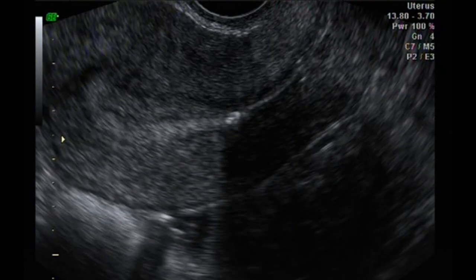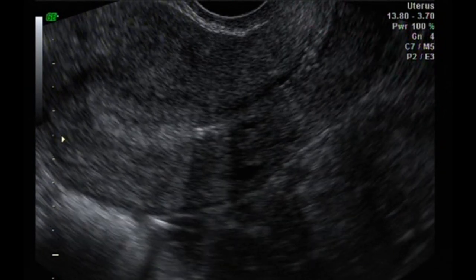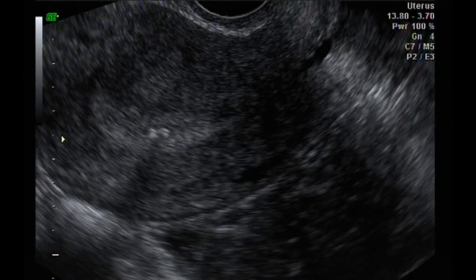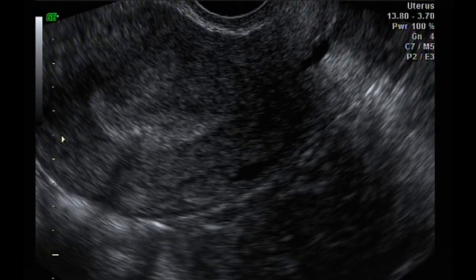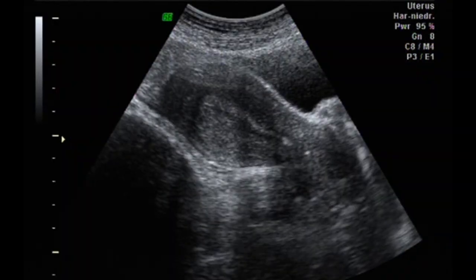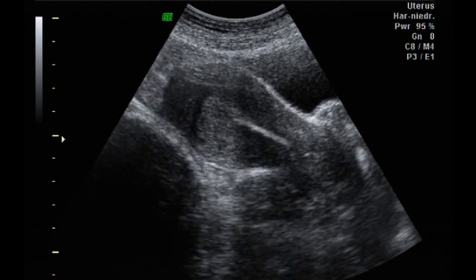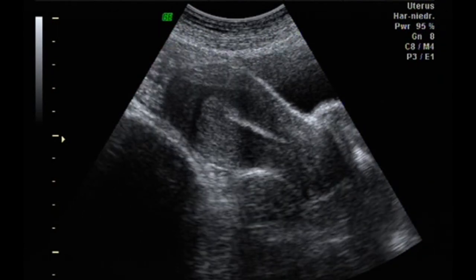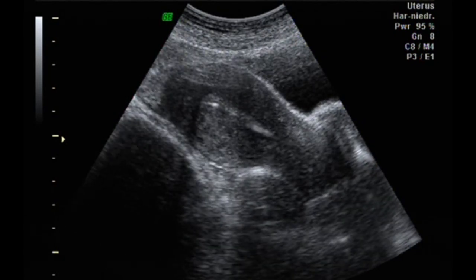Let me show you an actual video of a transvaginal guided embryo transfer. You could appreciate the echogenic tip of the inserted outer guide and the inner catheter moving out slowly and advancing towards the fundus. After injection, the marker air bubbles could be readily appreciated. In comparison, this video shows a classical transabdominal ultrasound guided approach with an echogenic catheter from a different manufacturer. Although this is a very nicely documented video, its resolution cannot be compared with the transvaginal approach.